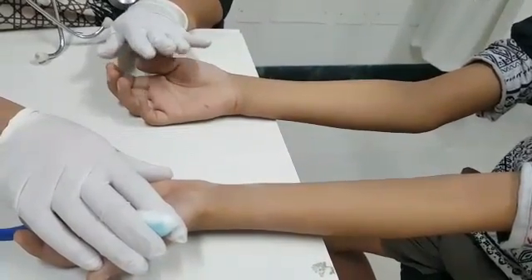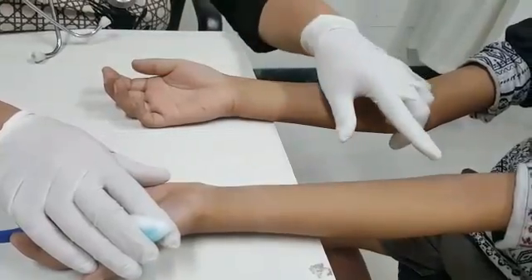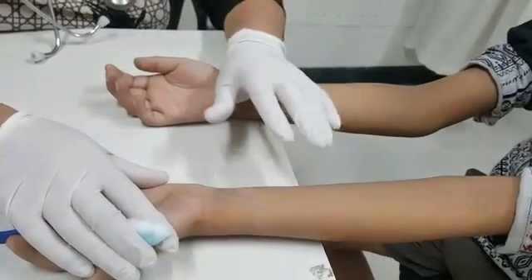In this procedure, it is not exactly a prick. It is just a touch on the skin when we put the drop of allergen.